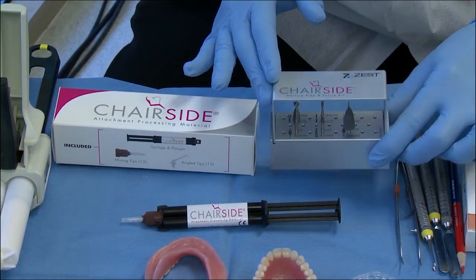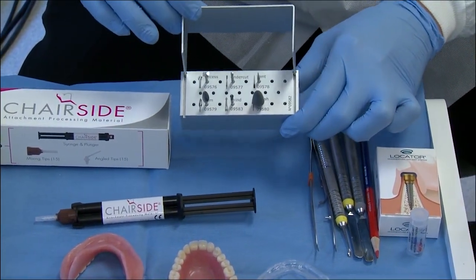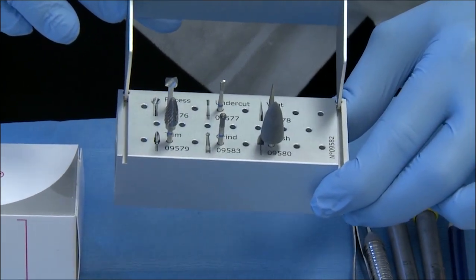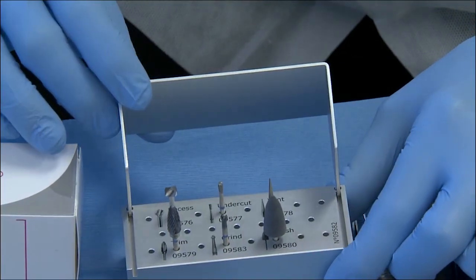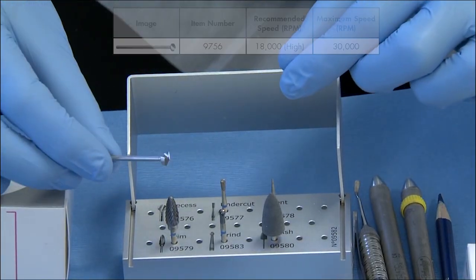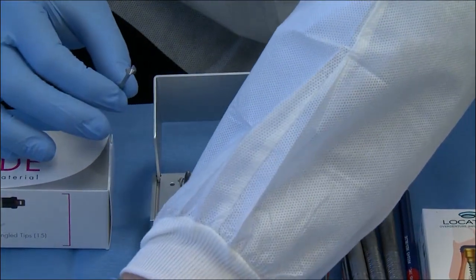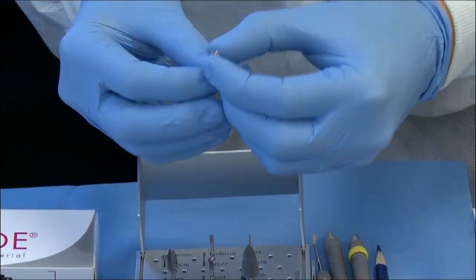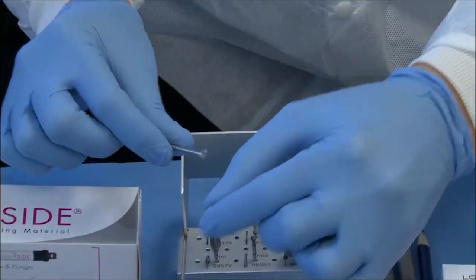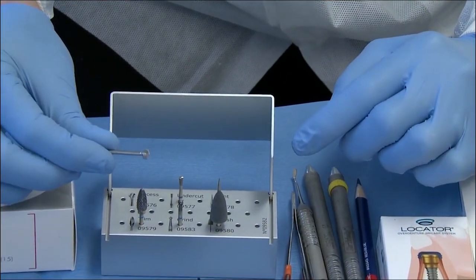The new Zest Chairside Denture Prep and Polish Kit fits in perfectly within the Chairside portfolio. As you can see here, it includes six burrs. The top three burrs are your preparation burrs and the bottom three are your trimming burrs, all enclosed in a very premium burr block assembly kit. The top three burrs — first, the Zest Locator Saturno Recess Burr is an innovative design, designed specifically by Zest Anchors to perfectly accommodate either a locator or Saturno attachment housing or denture cap. Sized precisely for efficient and precise recessed hole preparation.